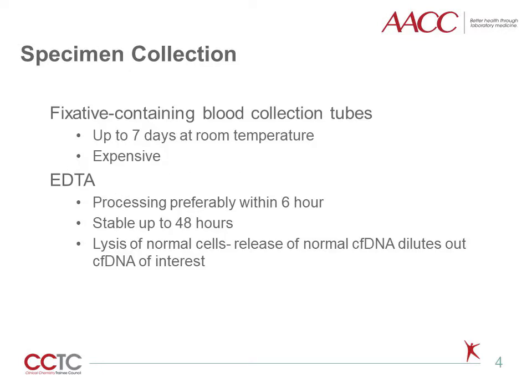As with all clinical assays, pre-analytical variables also affect cfDNA. Fixative-containing blood collection tubes are preferred that prevent lysis of nucleated cells. Blood can be stored at ambient room temperature up to 7 days without compromising the yield of cell-free DNA. But these collection tubes are expensive. Alternatively, EDTA can be used as an anticoagulant with recommended sample processing within 6 hours.